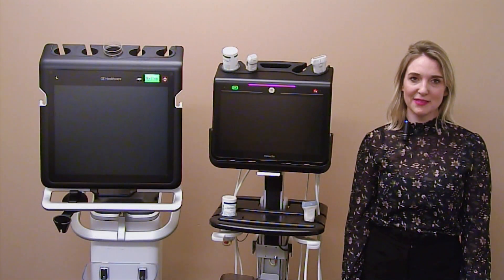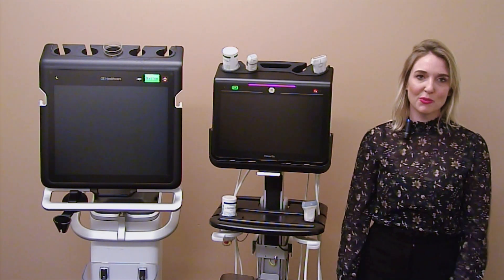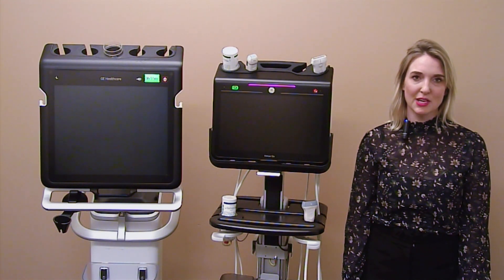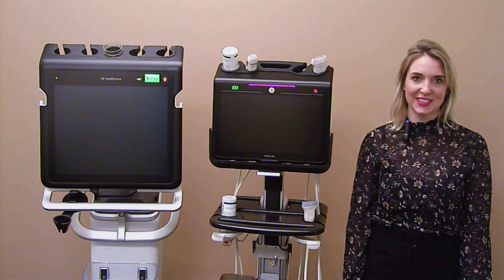Thank you for joining me today for our product introduction to the Venue and the VenueGo. For more information on the systems, the probes, or the cleaners, please refer to gehealthcare.com or your local representative. Thank you.